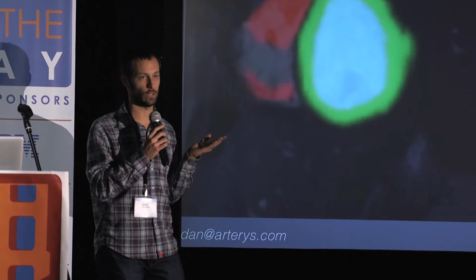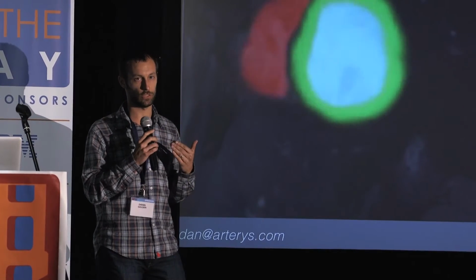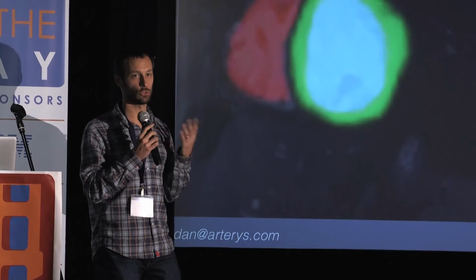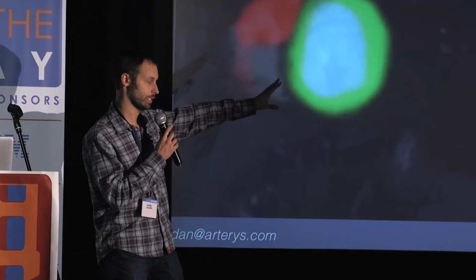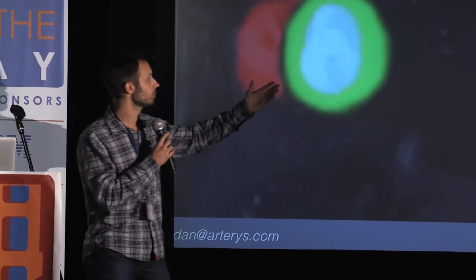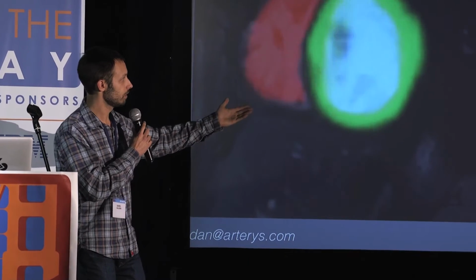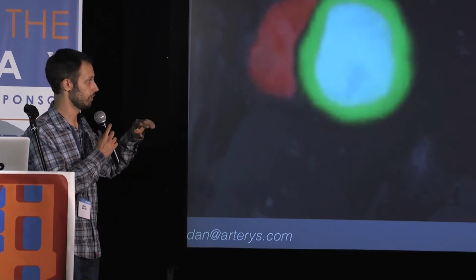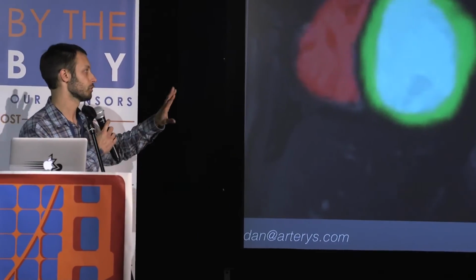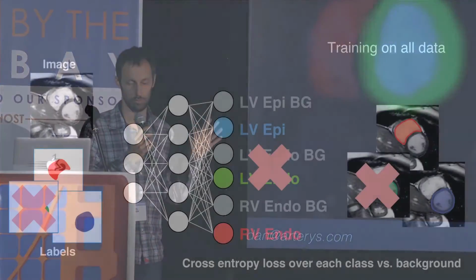And here I'm not talking about an FDA clearance issue because the radiologist has the opportunity to correct everything before determining clinical care. It's really a UX issue where the radiologist would essentially have to start from scratch with a right ventricle segmentation like this. The left ventricle segmentations look better, which is partially due to the fact that the left ventricle is a simpler shape, but still there's some noise there and some corrections would have to be made.